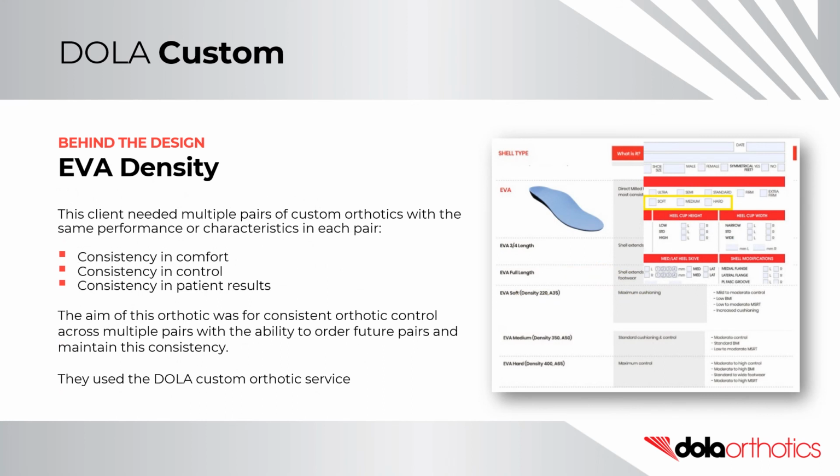Behind the design, EVA Density. This client needed multiple pairs of custom orthotics with the same performance or characteristics in each pair. They required consistency and comfort, consistency and control, and consistency in patient results. The aim of this orthotic was for consistency in orthotic control across multiple pairs, with the ability to order future pairs and maintain this consistency.